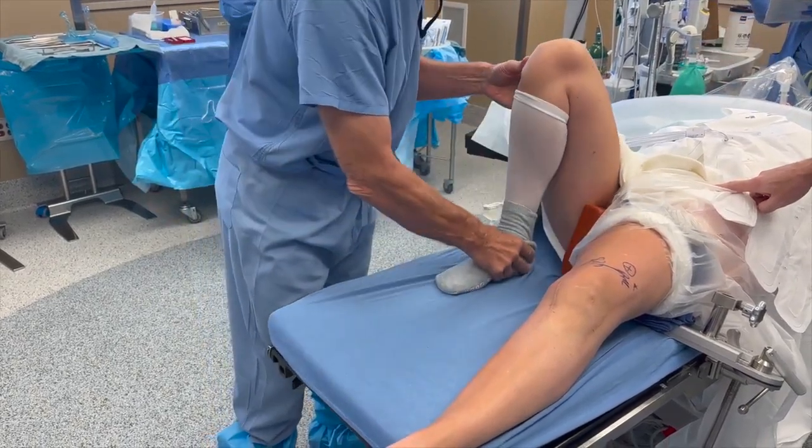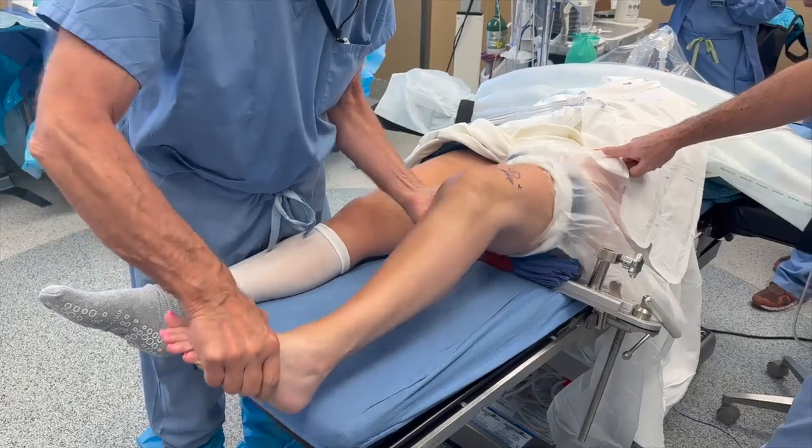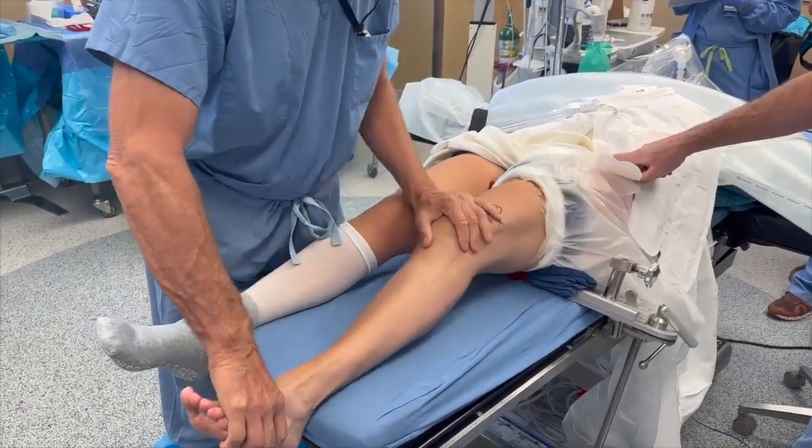A well-padded high thigh tourniquet is placed on the surgical limb. Both limbs are draped in a sterile manner, and the surgical leg is placed in a leg holder and the non-surgical leg into an abduction stirrup.